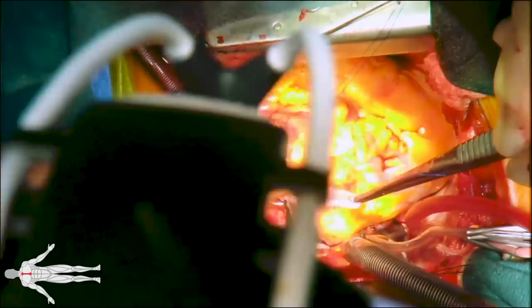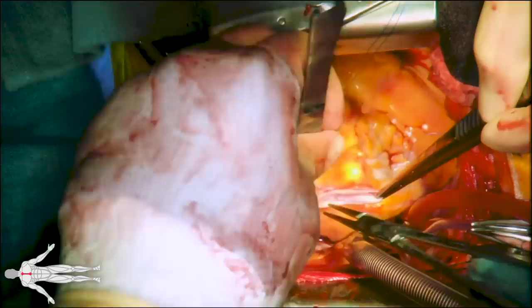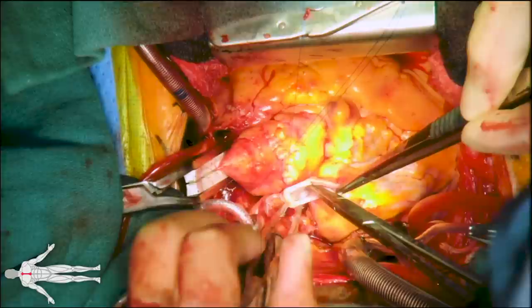We then proceed with creating an end-to-end anastomosis between the superior vena cava of the donor and recipient using a 5-0 Prolene suture in a running fashion.